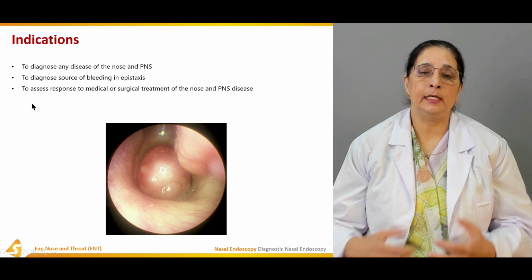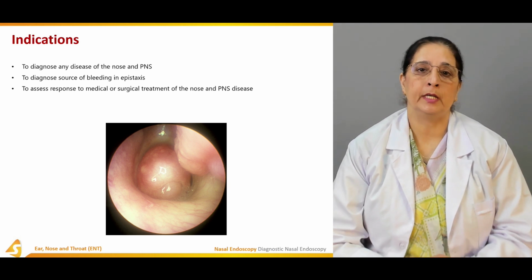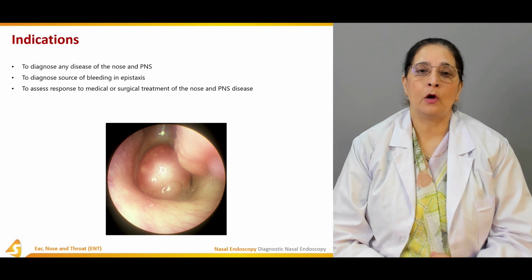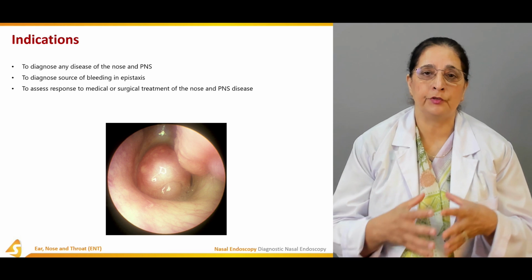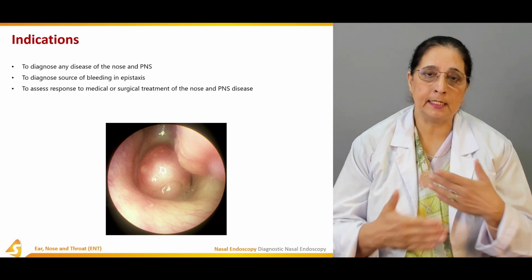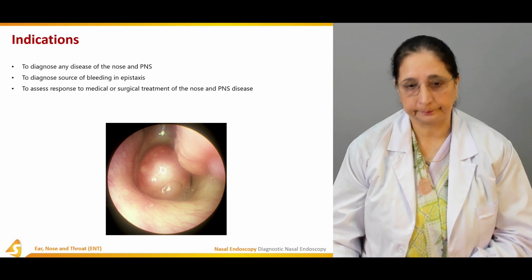To look at the effectiveness of the drugs or medicines used for the treatment of some diseases of the nose or paranasal sinuses, or of surgery, we can perform endoscopy to see how effective they were and how much the improvement is. All these are indications for diagnostic nasal endoscopy.